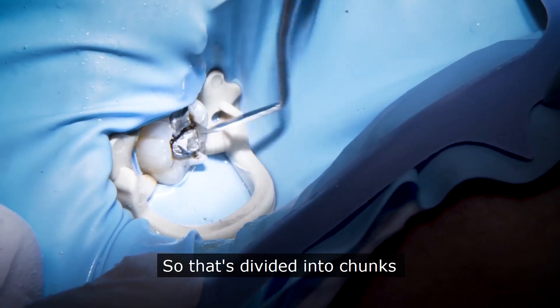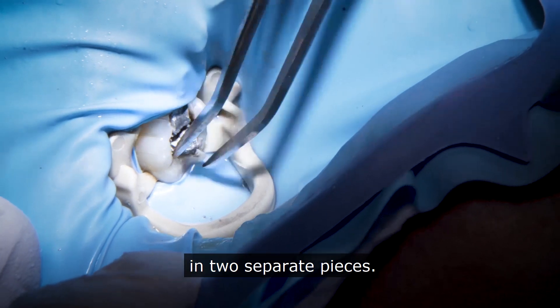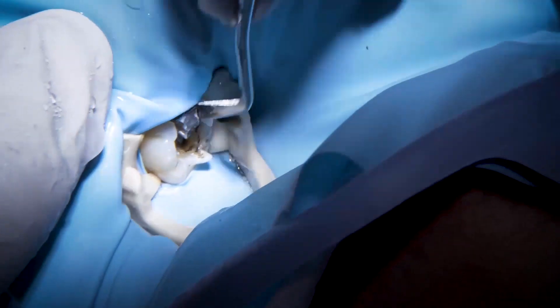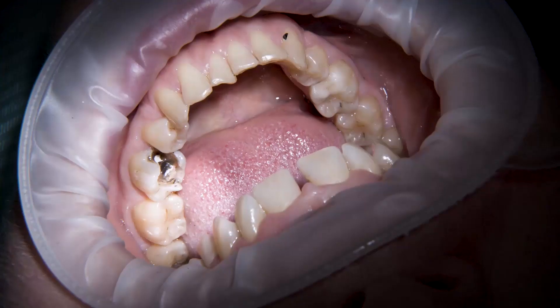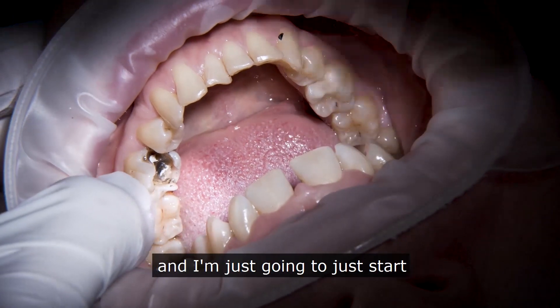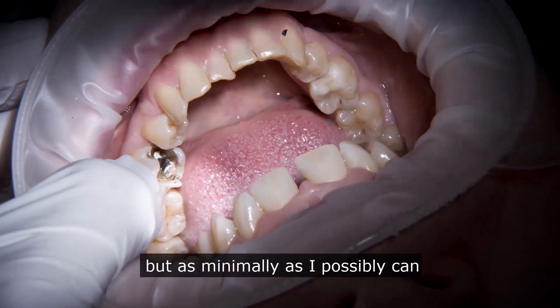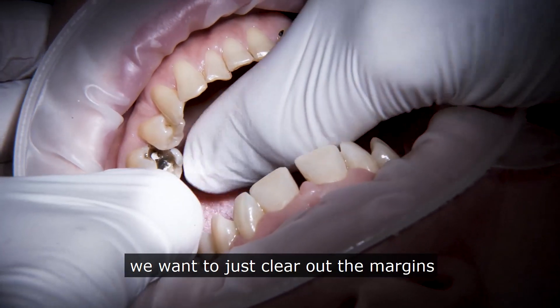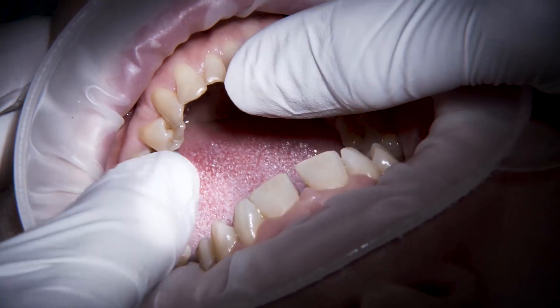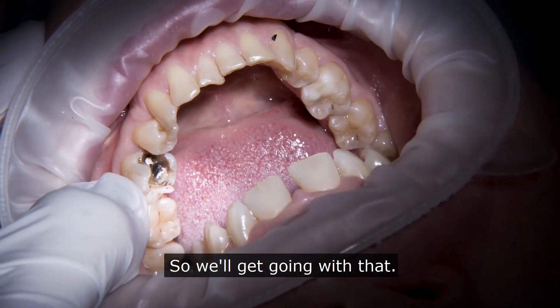That's divided into chunks and we'll get both pieces coming out separately now. We've cleaned the amalgam out and the worst of the debris. We've removed the rubber dam and I'm just going to start shaping that cavity as minimally as I possibly can — just clearing out the margins and taking it down to something that's sound.